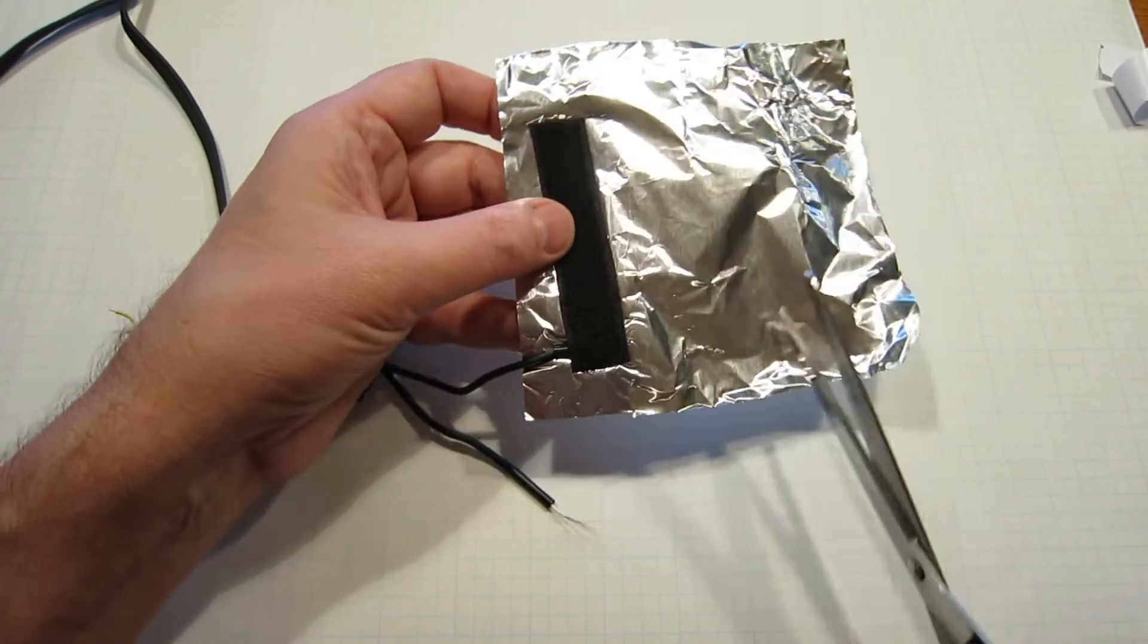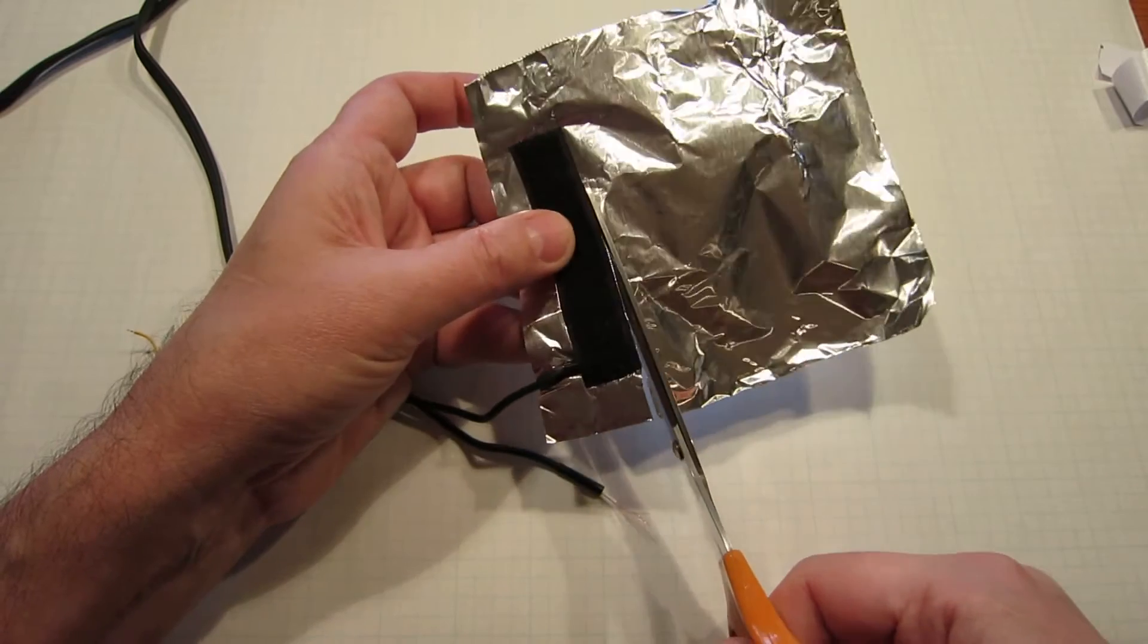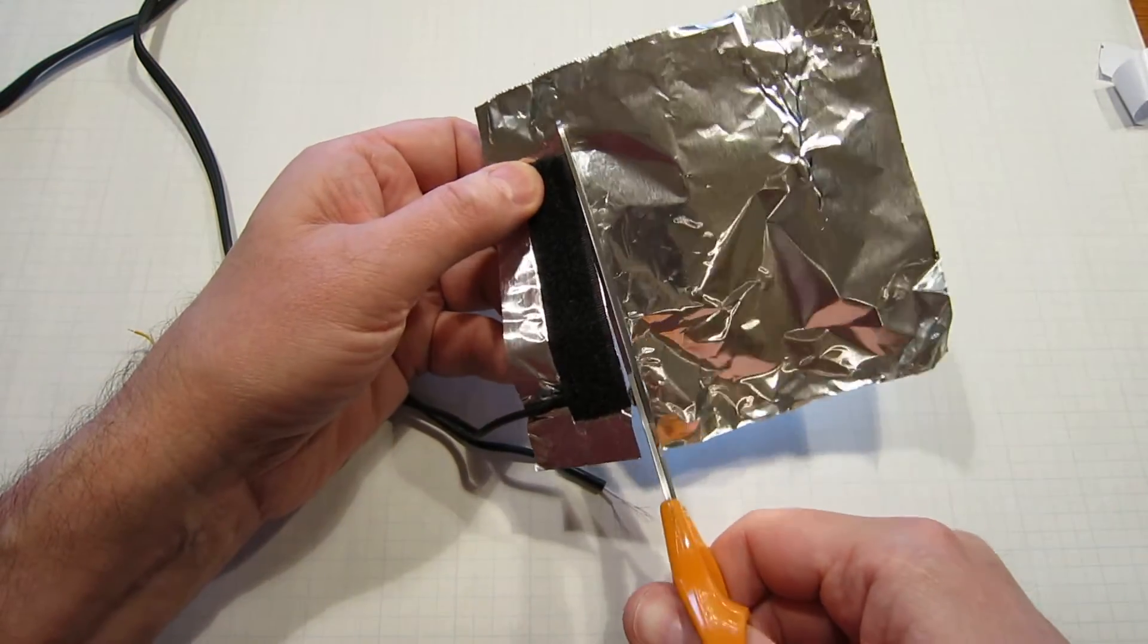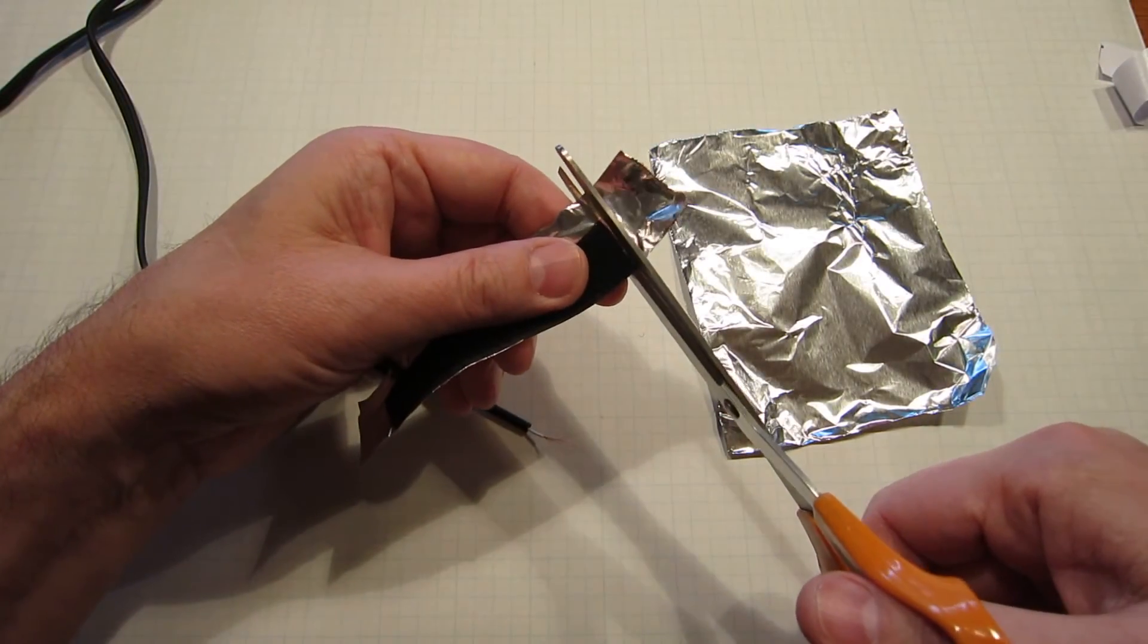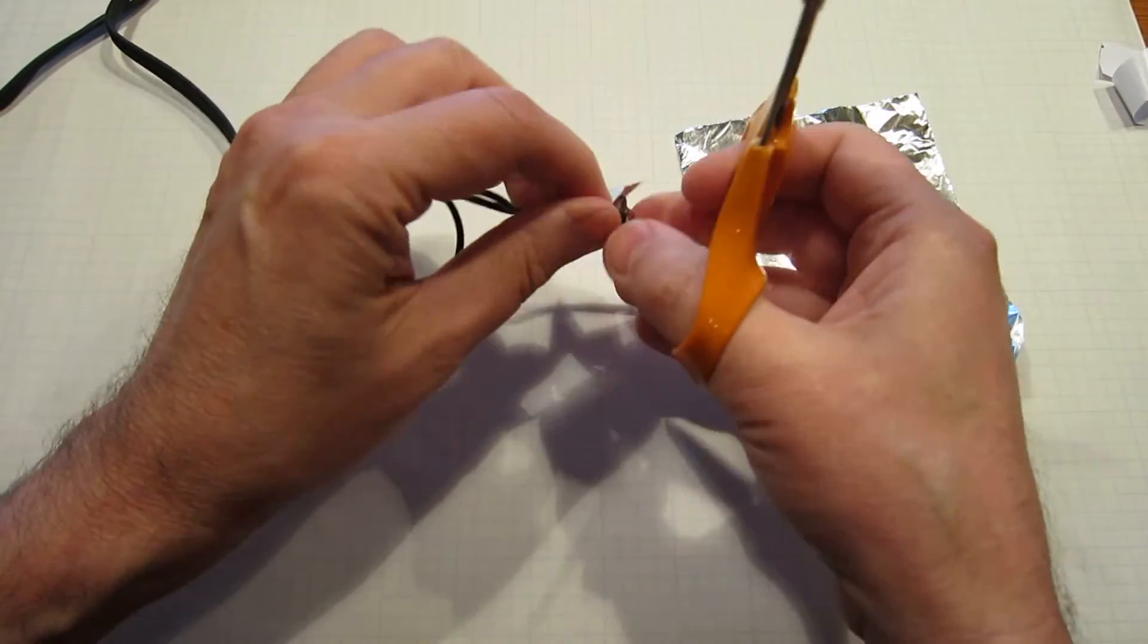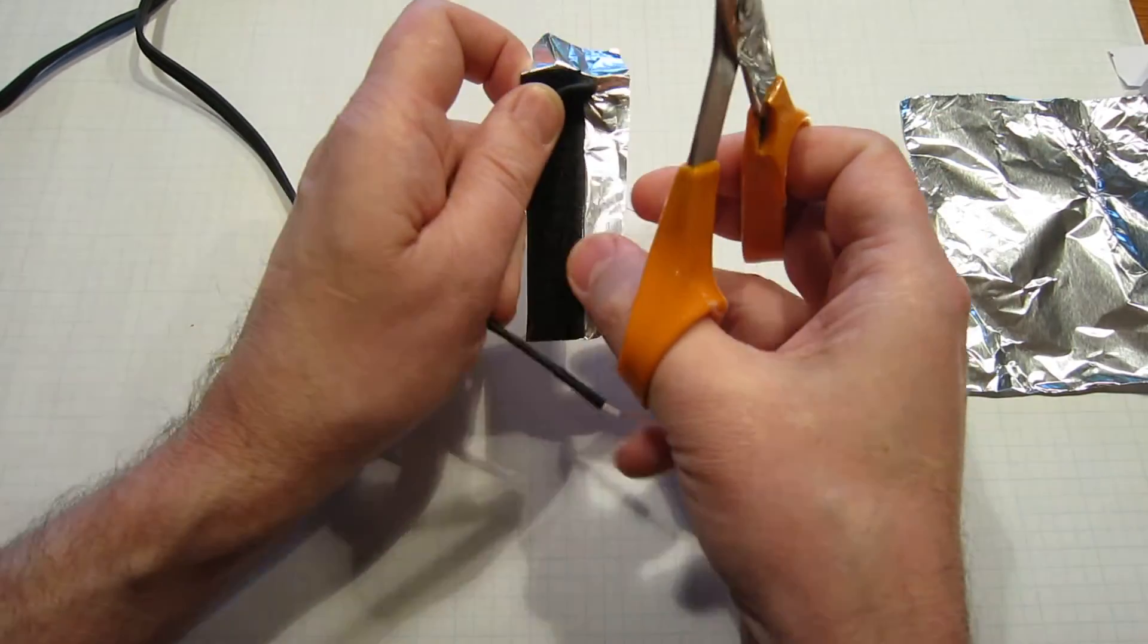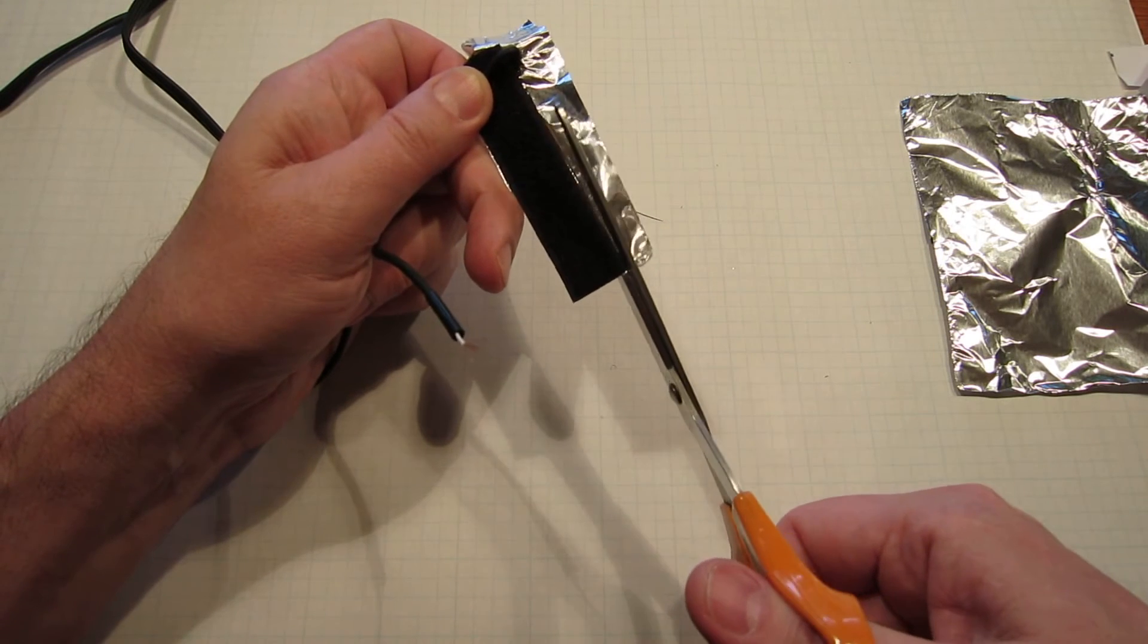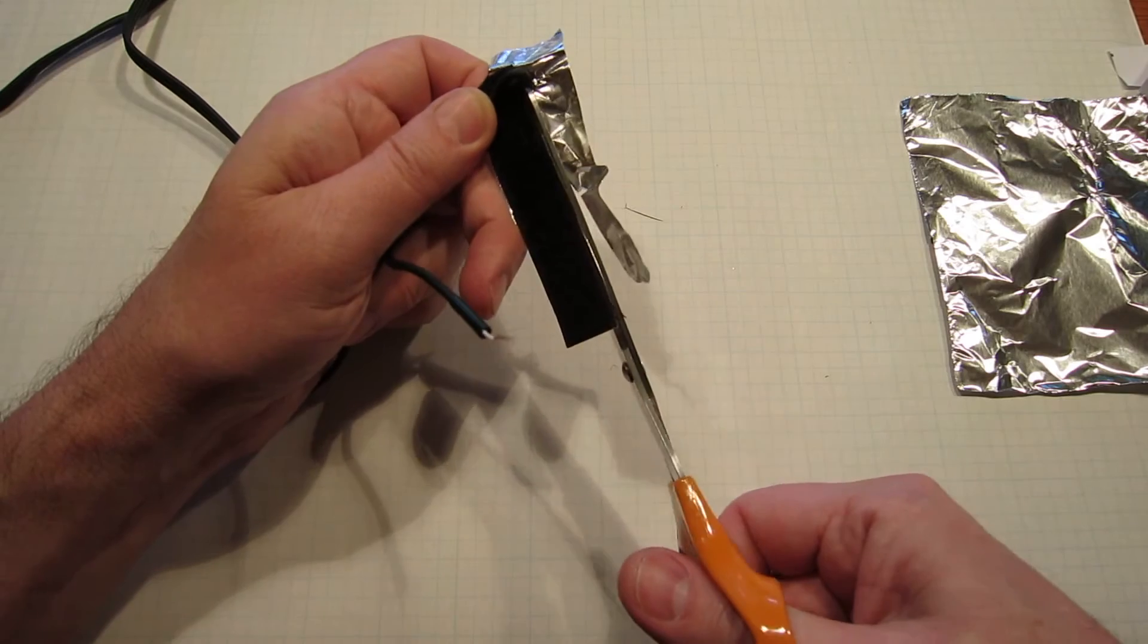Then you just need to trim around to cut off any excess aluminum foil. Make sure you don't accidentally cut the wire. You're going to do the same thing with the white wire.